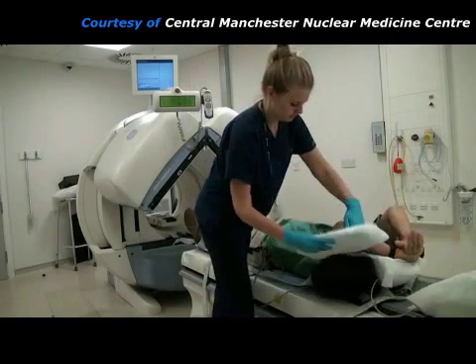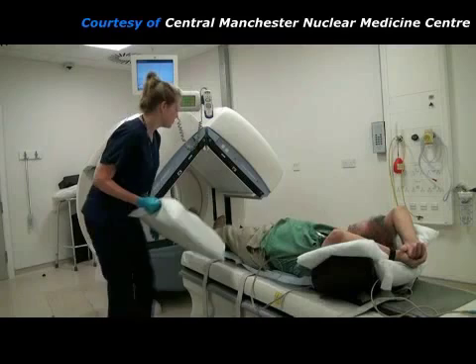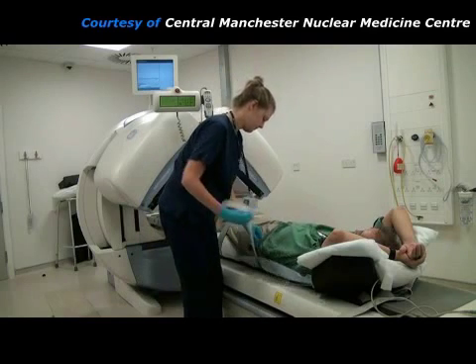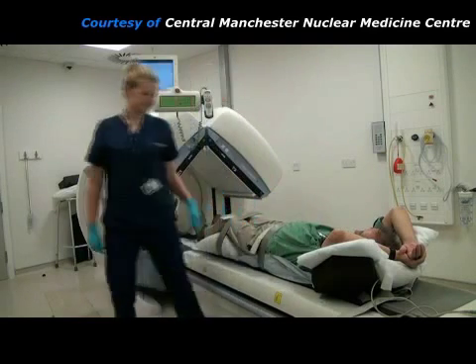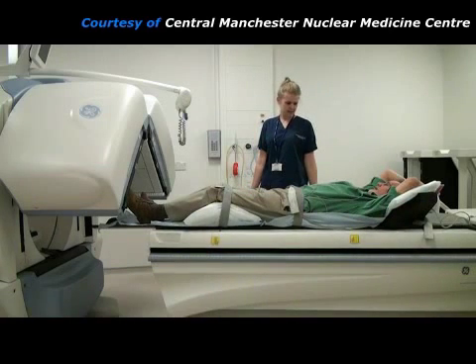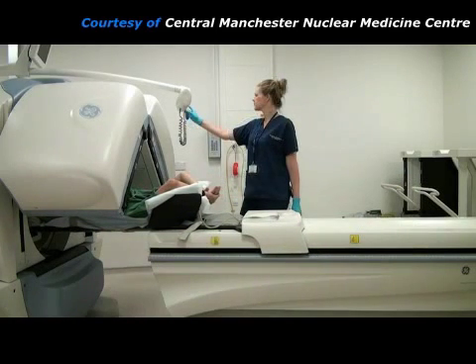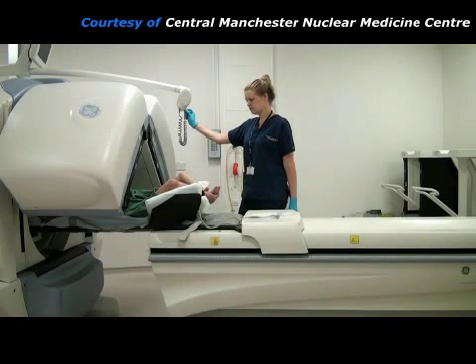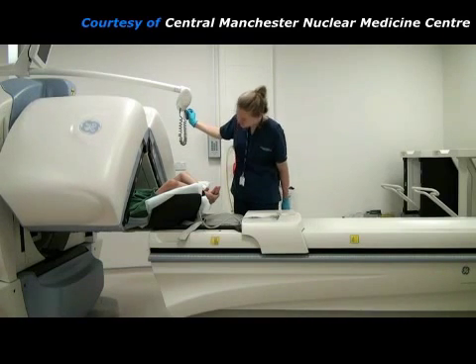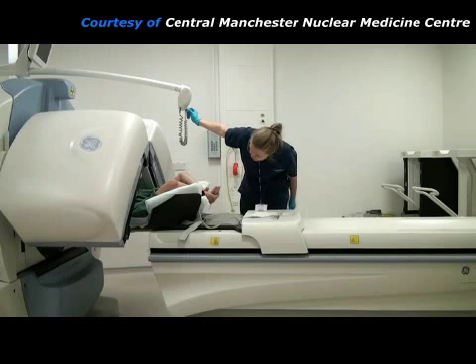The patient raises his arms above his head so that they will keep out of the way of the camera. Knee supports and velcro bands help to keep the patient in a comfortable position. The imaging couch moves towards the gamma camera until the patient's heart is positioned in front of the two detectors. The patient's head stays outside the detectors, but they must move close to the patient's chest in order to get good pictures of his heart. The detectors will come close to the patient but there are sensors to prevent them from actually touching.